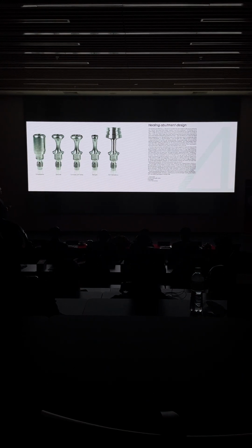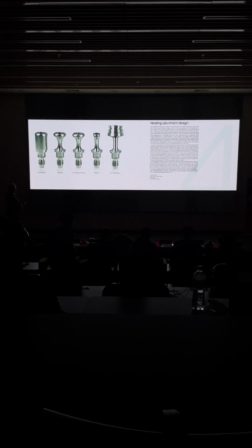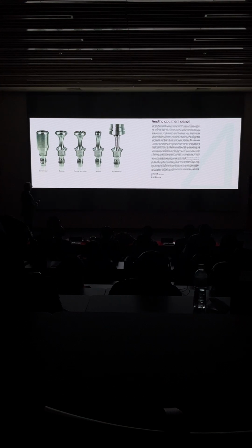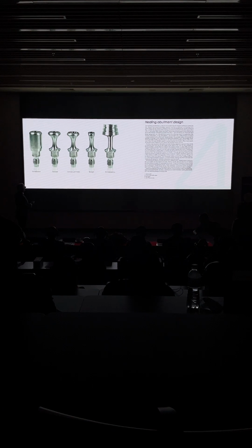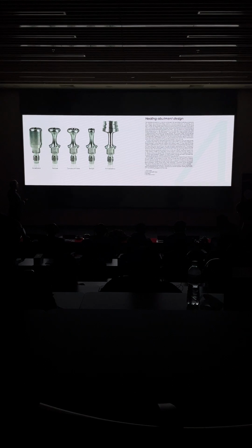So you can see that with this abutment, I always saw that the tissue was gliding. It was never staying level to where I placed it. So I thought that making some holes in the healing abutment would favor the suturing in a better way. But actually, this is not easy, and I will show you why. But this guy was beating all of them. As soon as I took the platform off, the tissue even grew on top of it and was disappearing. And then I saw that the more I was resting on top of my healing abutment, the less cracking of my provisional. And I decided to place a prosthetic head.